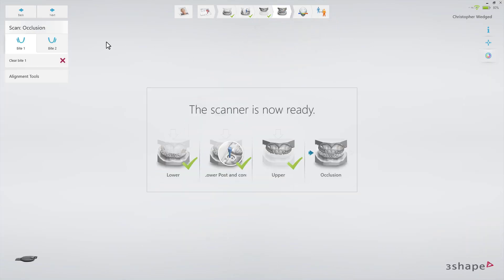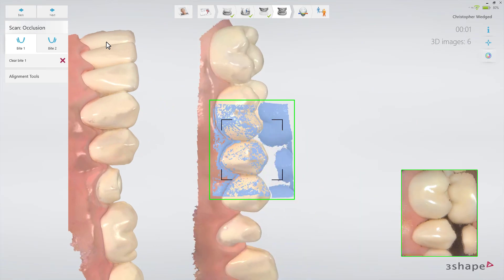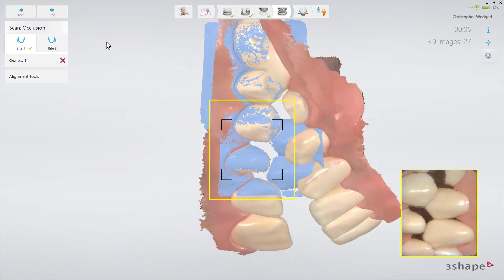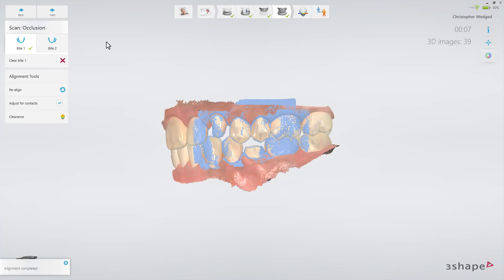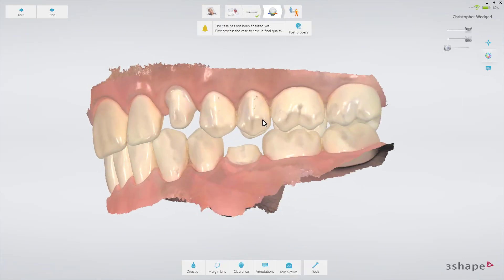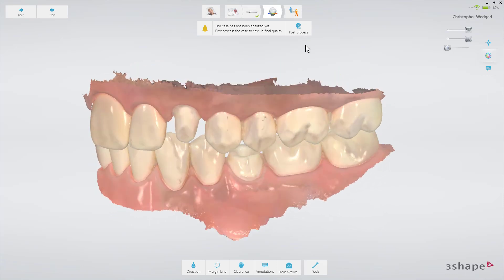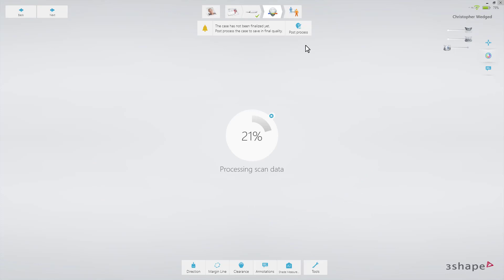Now remove the scan post and scan the bite. Switch to the Analyze page to confirm that there is enough space for the reconstruction between the upper and lower jaw. Set the margin line and optionally add some comments or shade measurements.